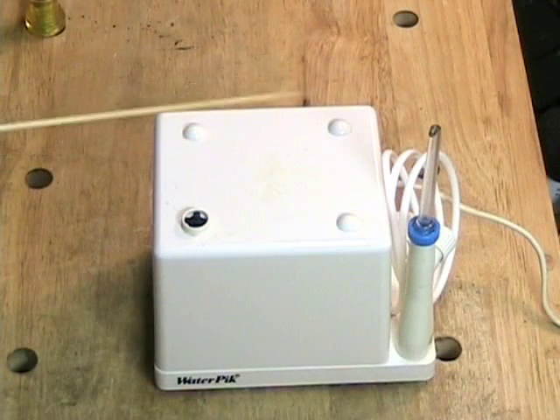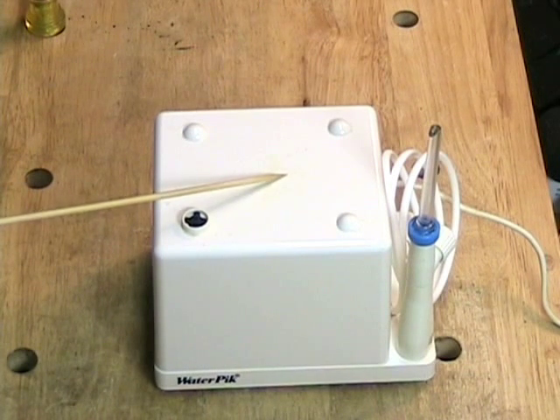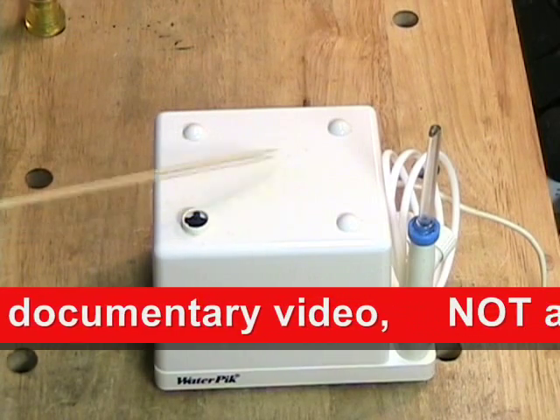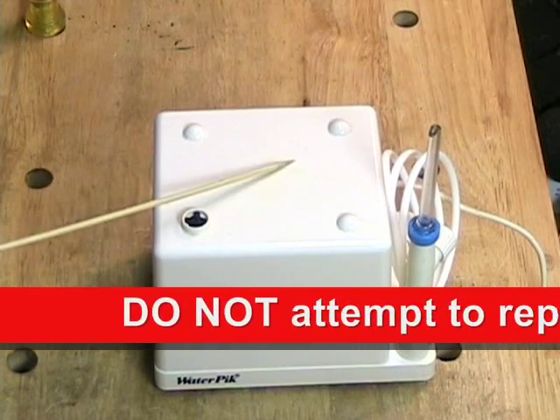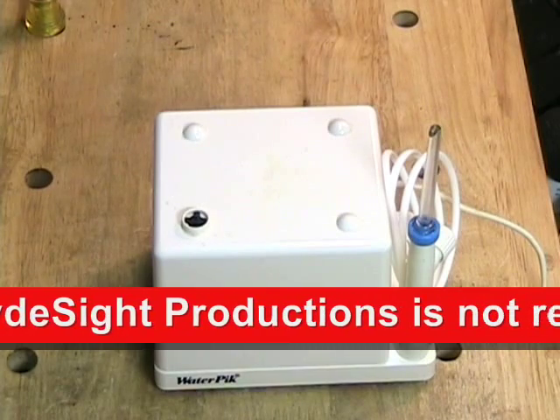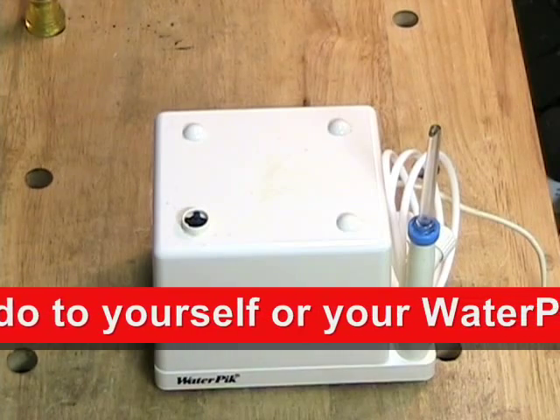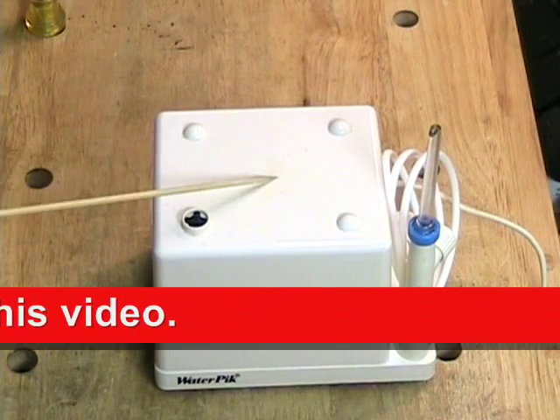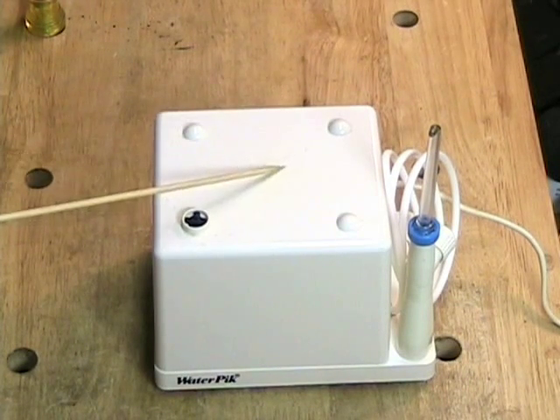Before I begin the video I want to give you a warning. Water pick is an AC powered device that works with water to clean your teeth. Electricity and water obviously do not mix. If you have a water pick and anything goes wrong with it, don't attempt to repair it yourself. Send it back to the water pick people and they will fix it and return it to you. Play safe. Clydesight Productions is not responsible for anything that you do to your water pick or yourself as a result of watching this video. This video is a documentary of how this particular machine works. It is not intended to teach you how to repair a water pick. Do not attempt to repair a water pick yourself.